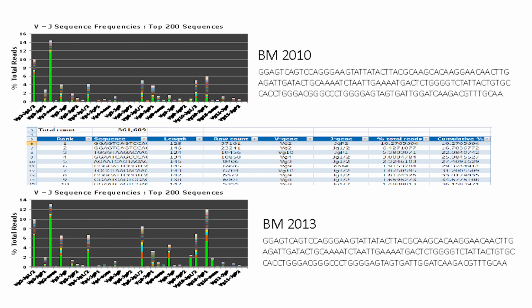This patient was followed up all the way to 2013. He was cured from the parotid lymphoma, but the bone marrow continued to show exactly the same clone and had active T-cell lymphoma in circulation, but it was a completely different lymphoma. So very interesting patients that you wouldn't know that they're out there if you're not doing the NGS assay.